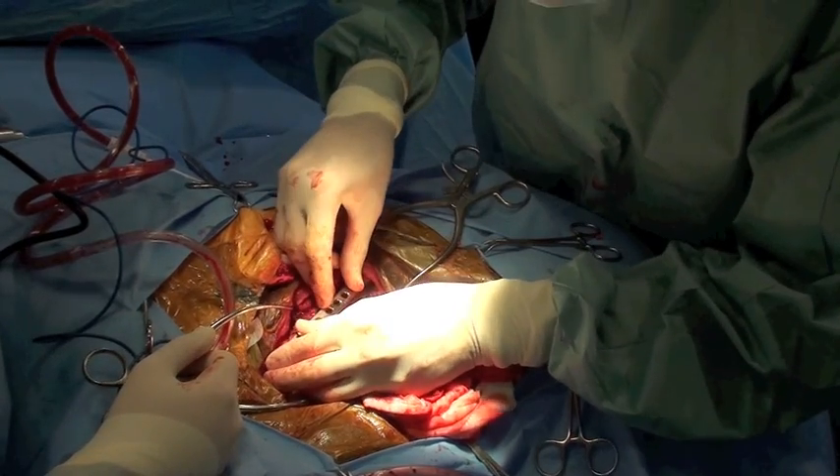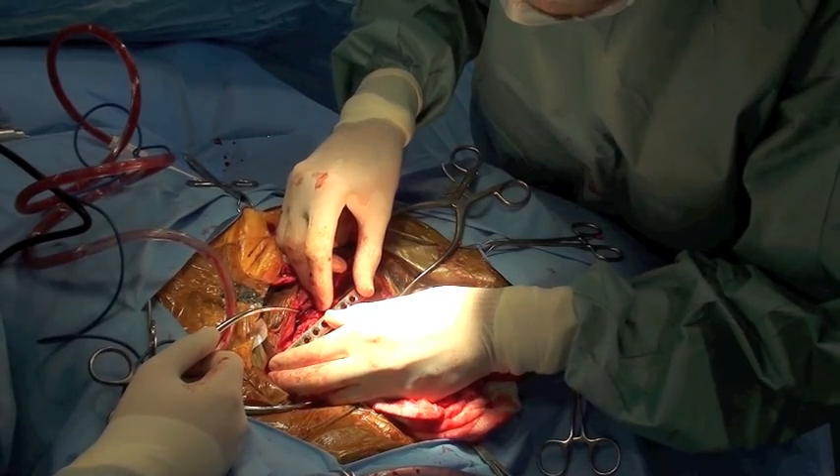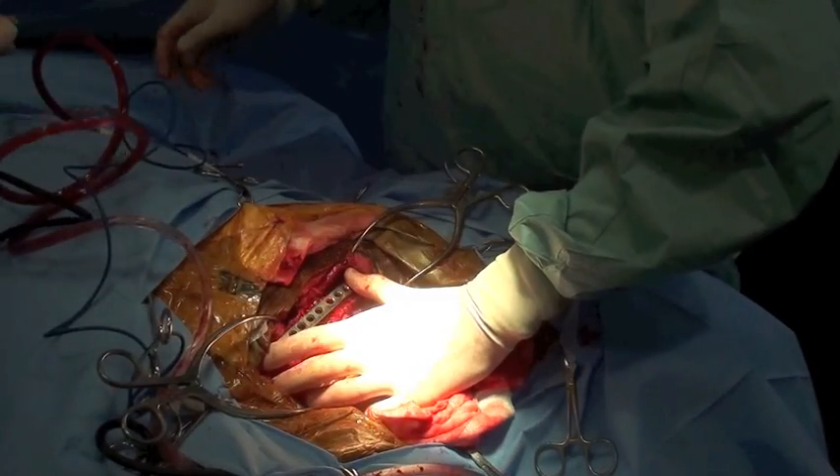After radiation therapy and the lead sheeting has been removed, a plate is affixed to the lateral aspect of the humerus in order to provide support for the weakened tumor bone.